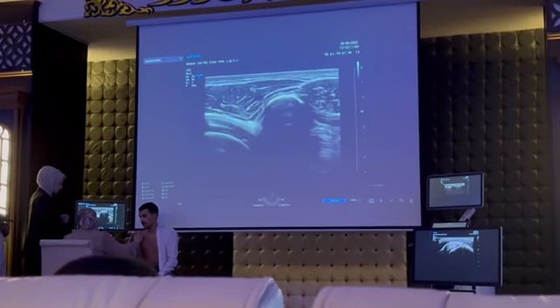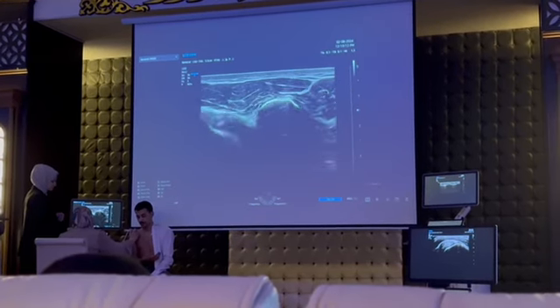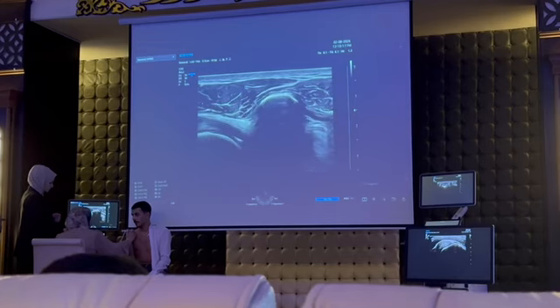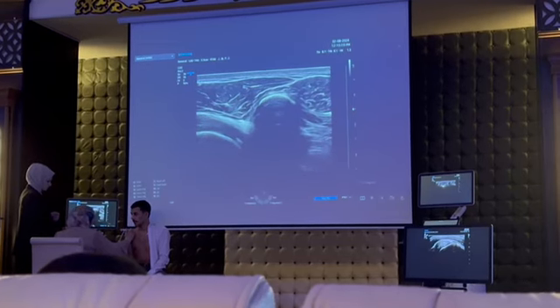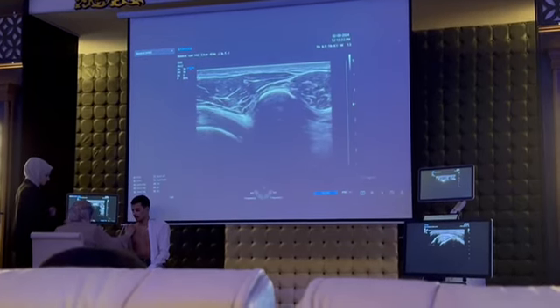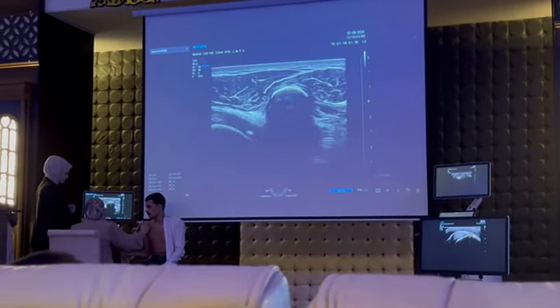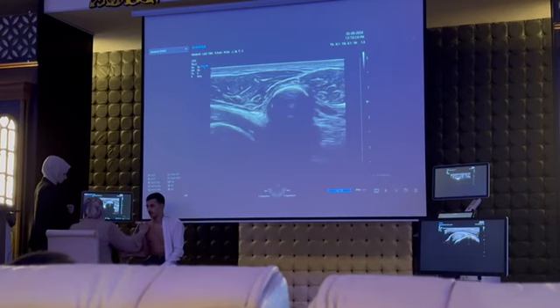At which point should we consider this impingement test positive? Ask the patient if there is pain, so it is positive. Any pain you feel? So impingement test now is negative.